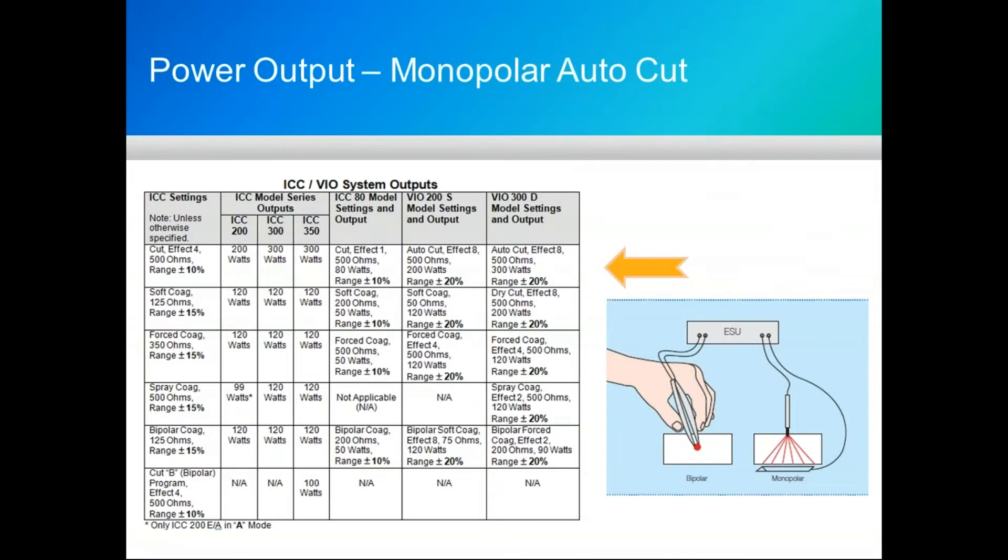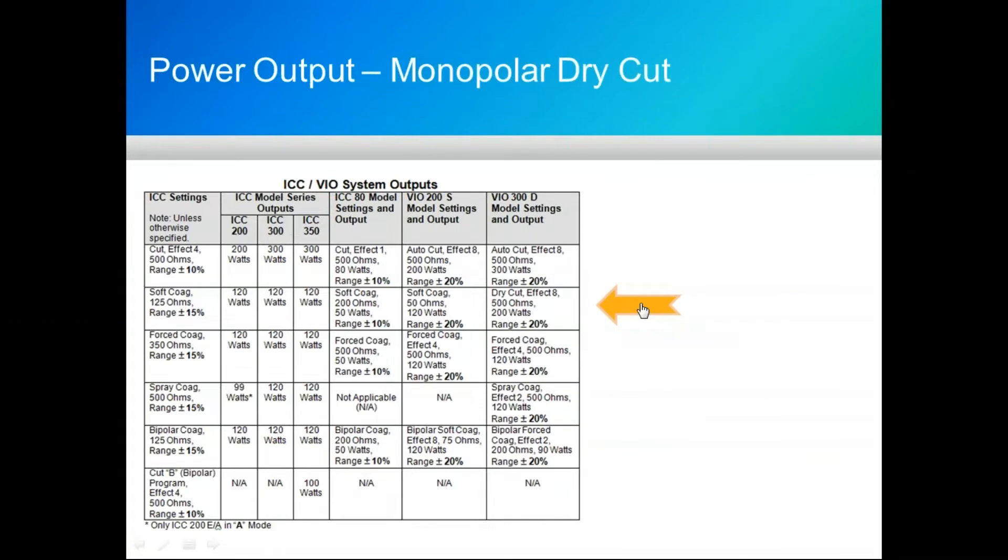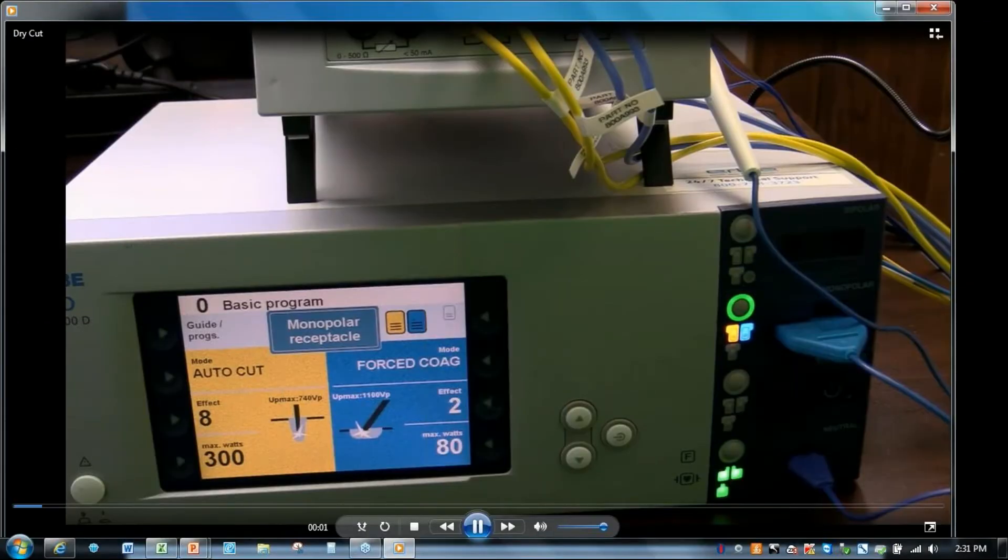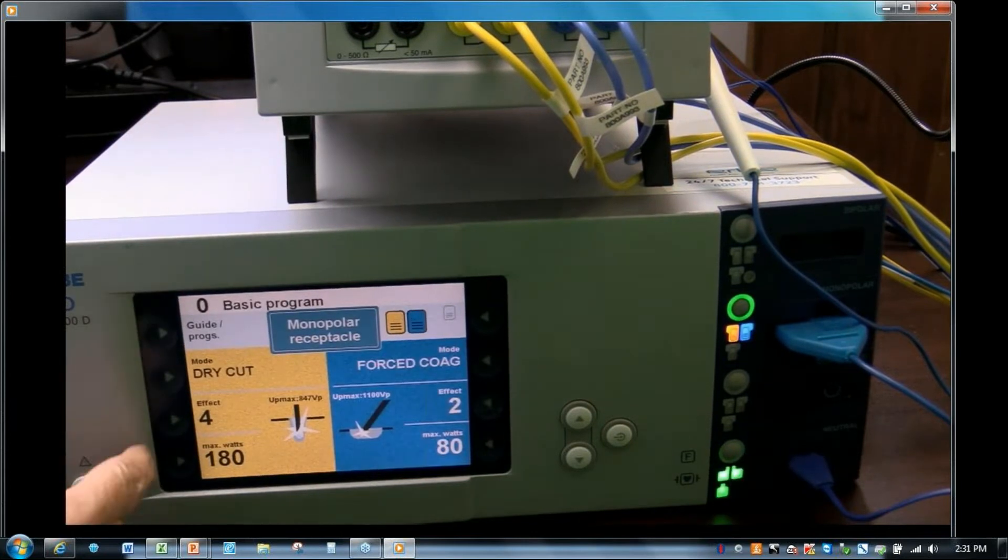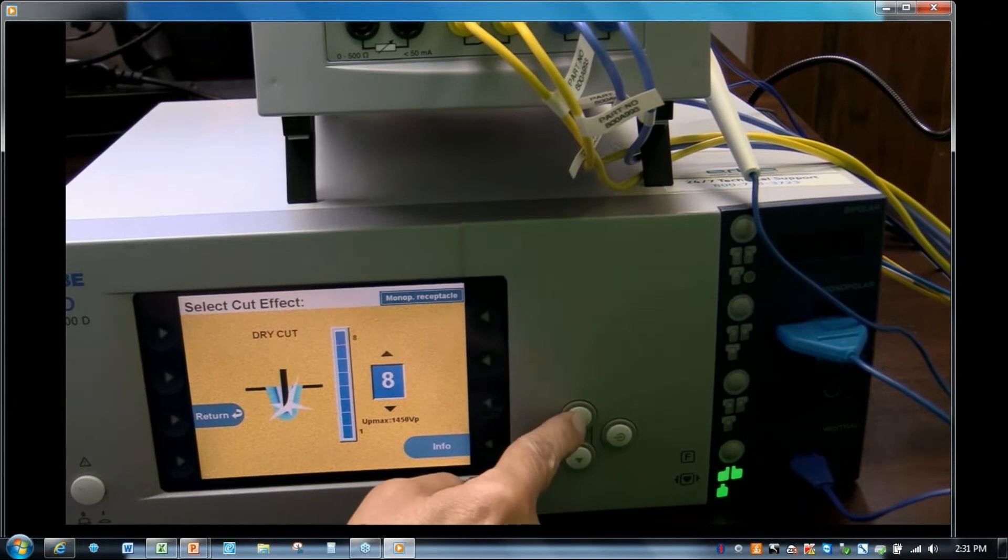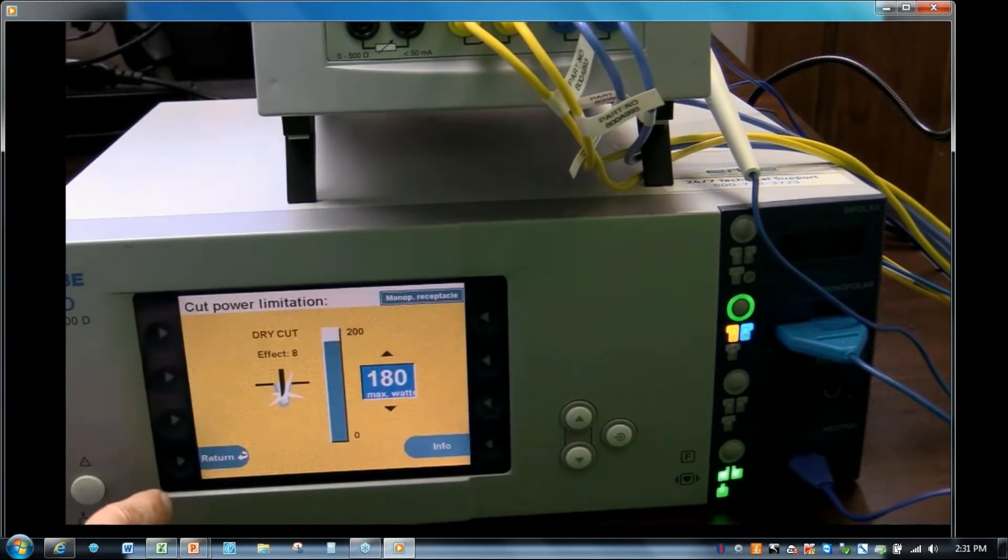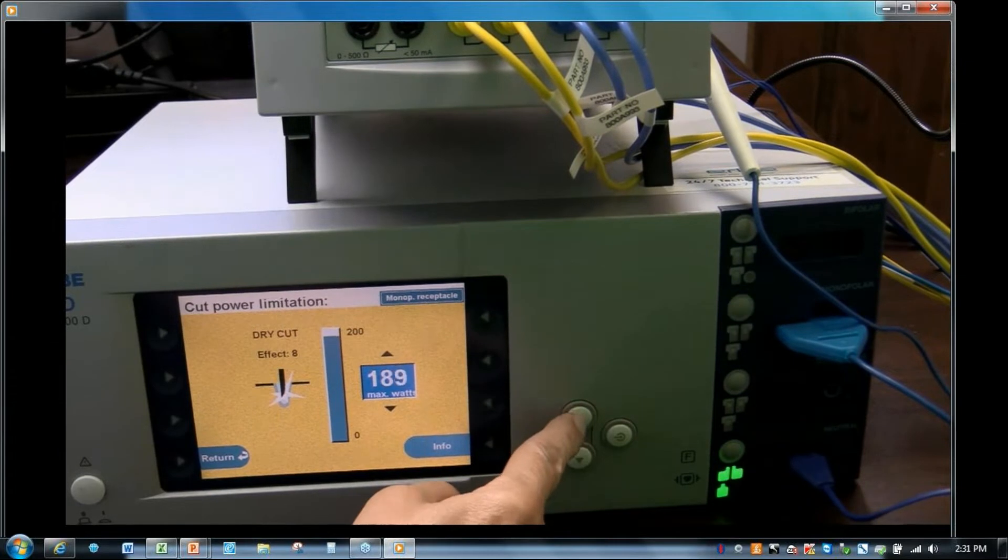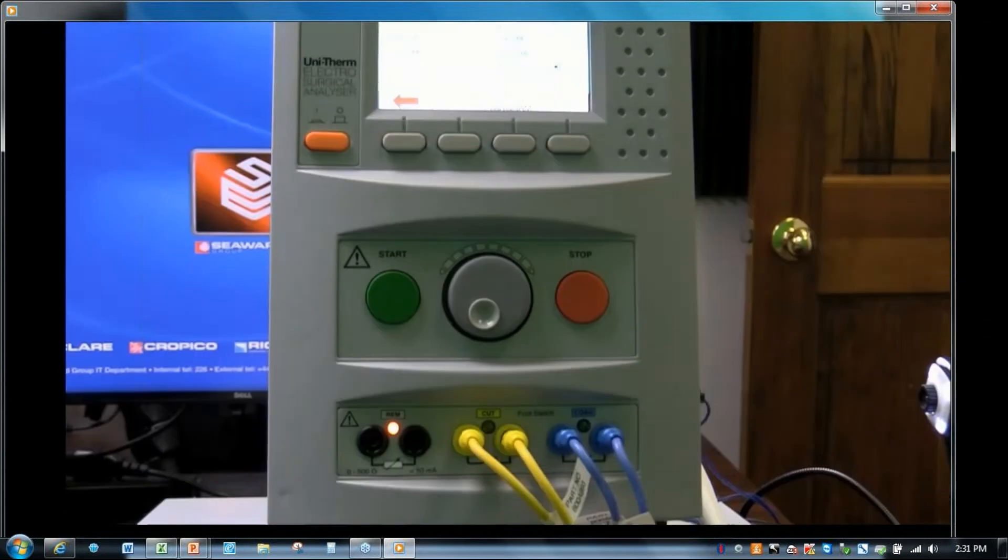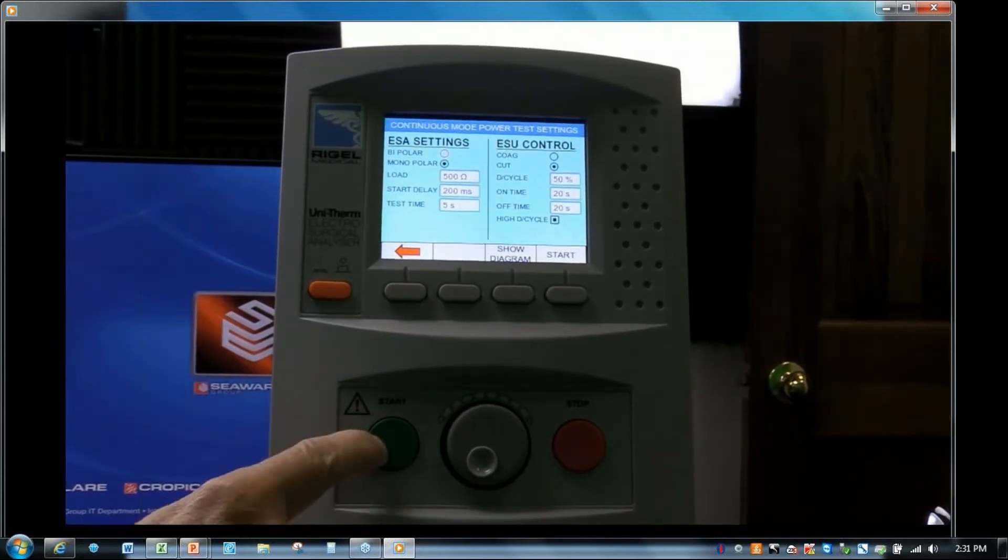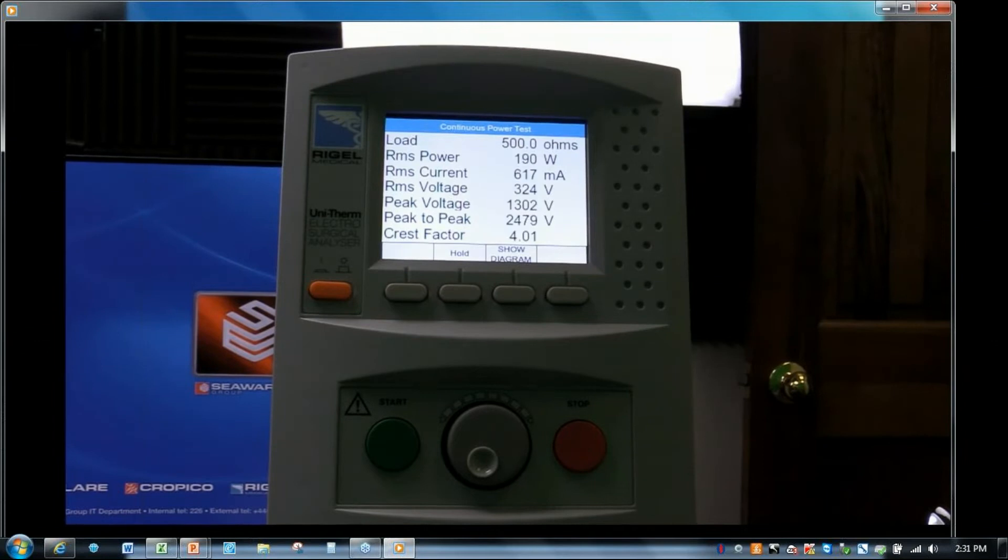That was our auto cut. Now we're going to change things around and do the dry cut. Notice the visual is changing a bit depending on the effect settings and selections I make, whether it's auto cut or dry cut. Start my test and capture my data.